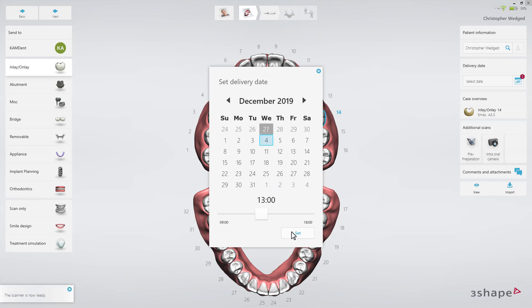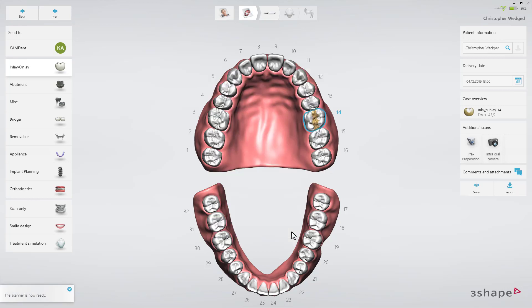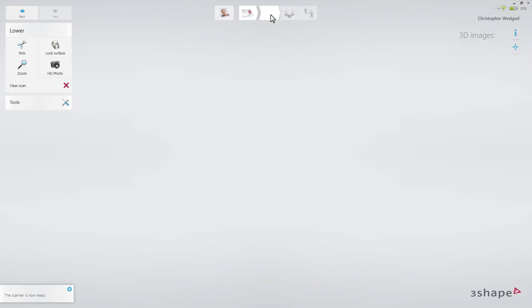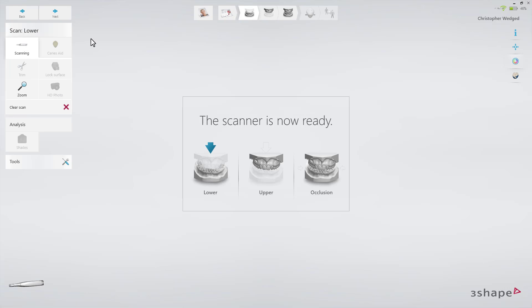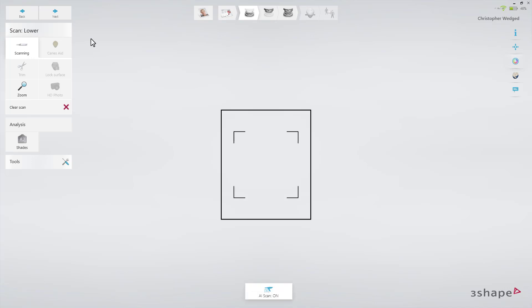Now proceed to the scan page. Use a retraction cord and/or a hemostatic agent if parts of the margin line are subgingival. In this case, start by scanning the opposing arch to allow time for the retraction methods to take effect. We'll start by scanning the lower arch.